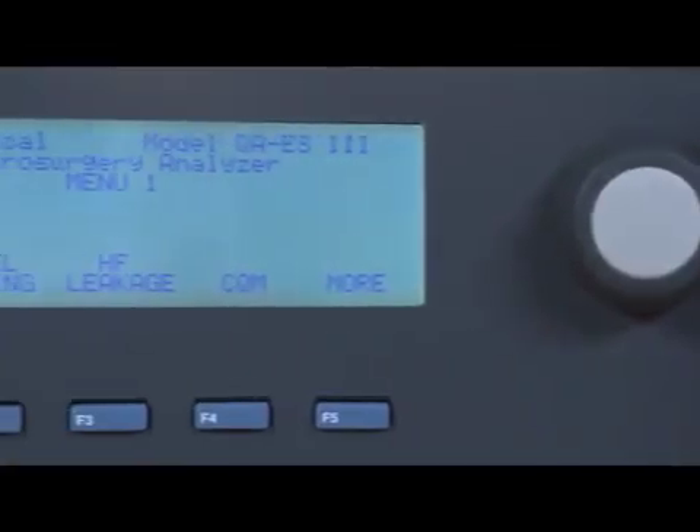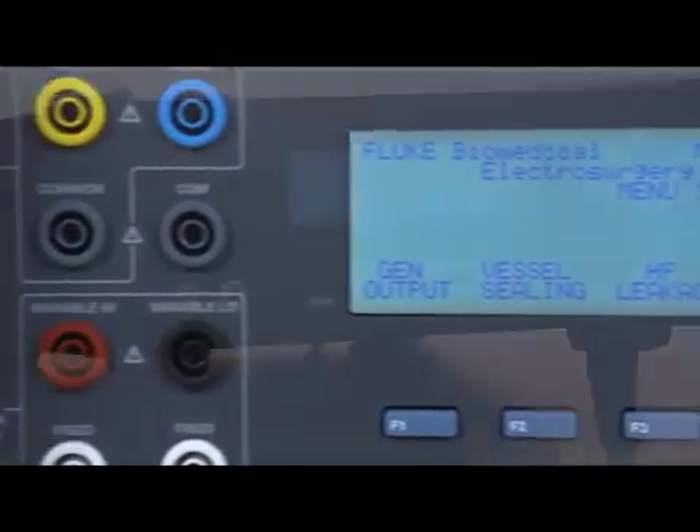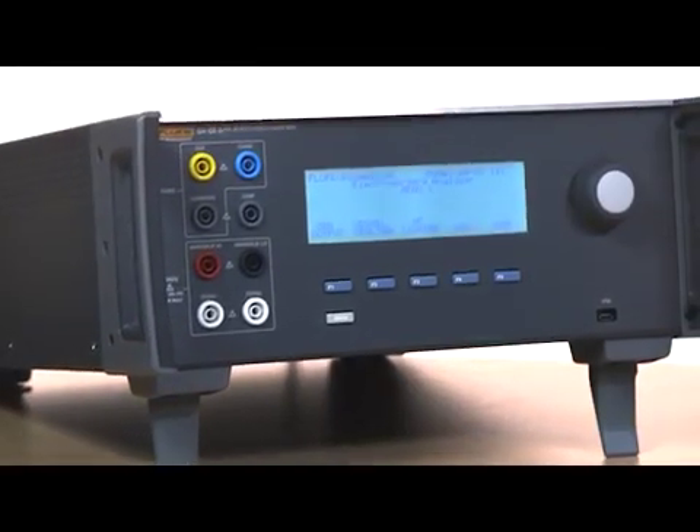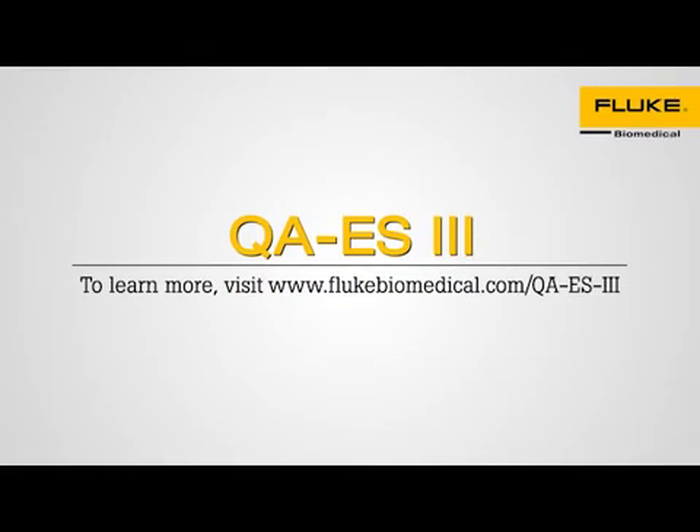The QAES-3 is an all-in-one analyzer to get the job done accurately and quickly. With industry-leading specs, the QAES-3 can test all modern high-power electrosurgical units. To learn more about the QAES-3, please visit flukebiomedical.com. Thank you.